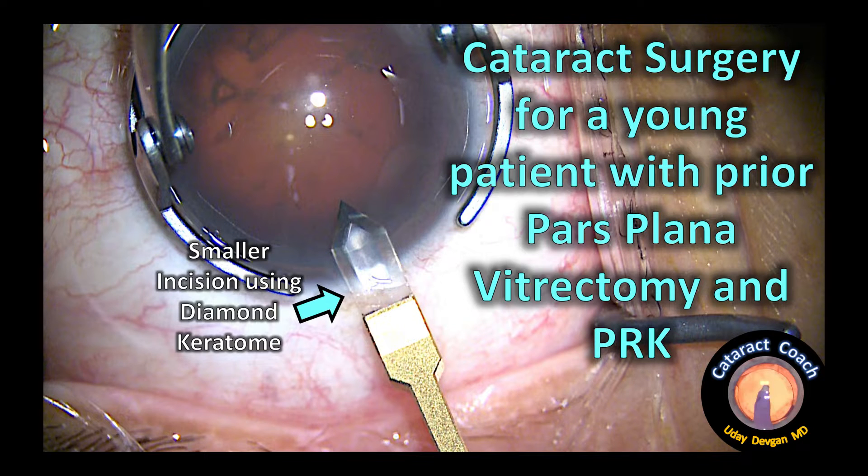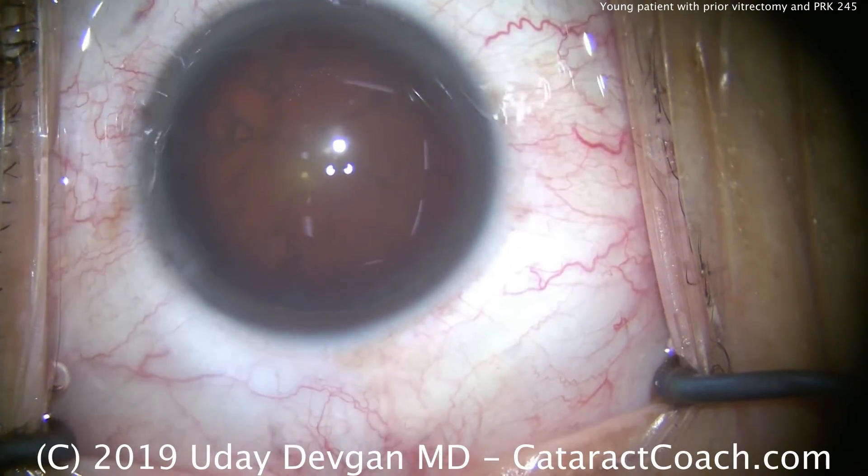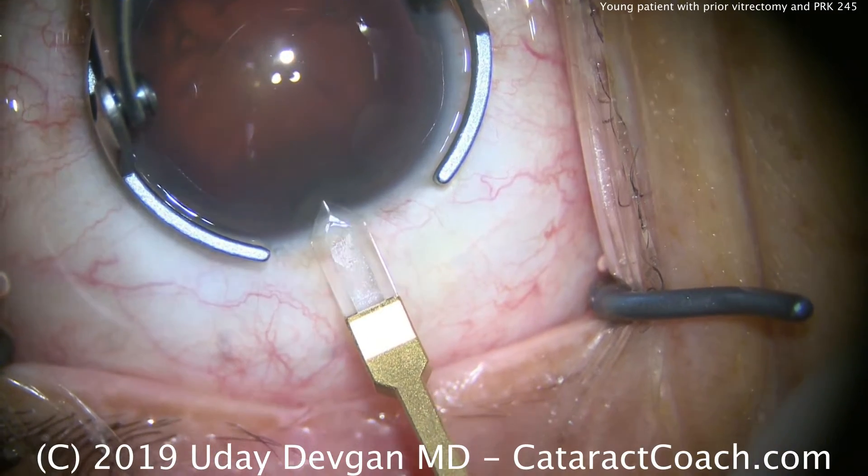Cataractcoach.com. In a patient with a prior pars plana vitrectomy as well as PRK, let's see how we do things differently. This is a young patient, under age 50, and he's had two prior vitrectomies.